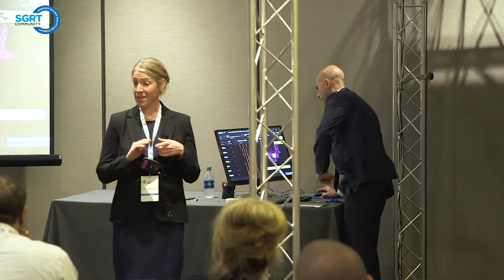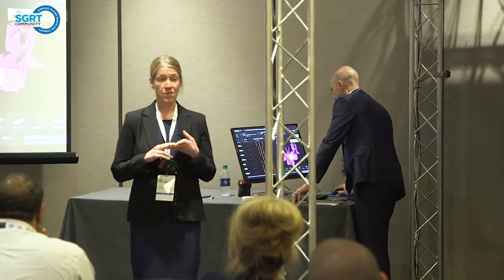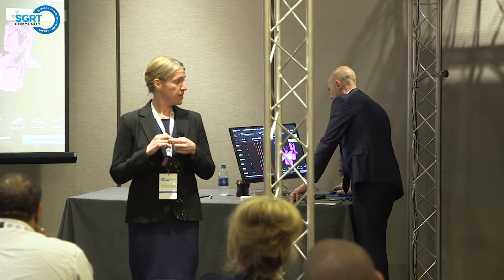Okay. Perfect. Going with our acronym TREAT, the first thing we want to do is line our patient up to the treatment isocenter, whether that be tattoos or if you're in a tattoo-less environment.